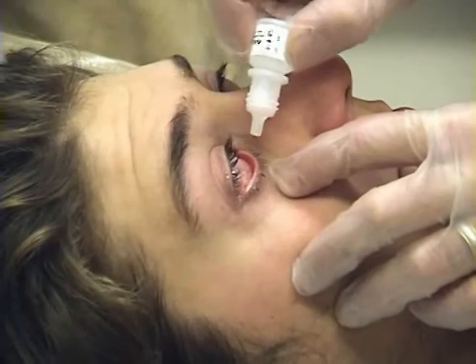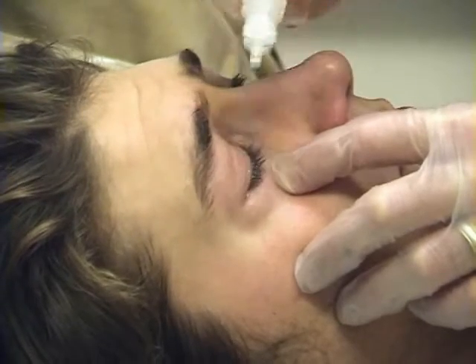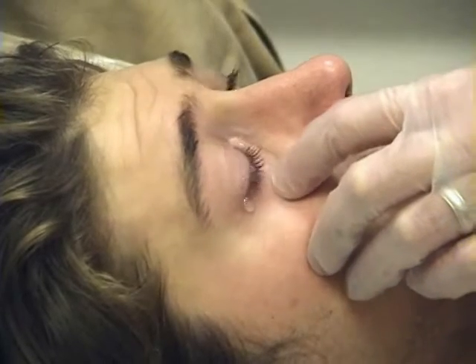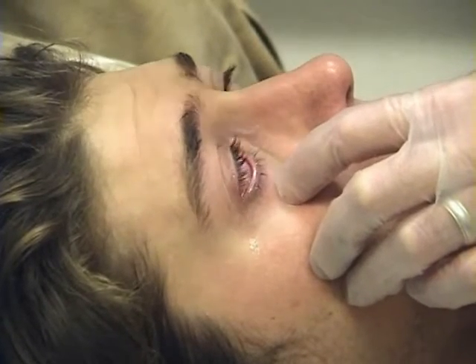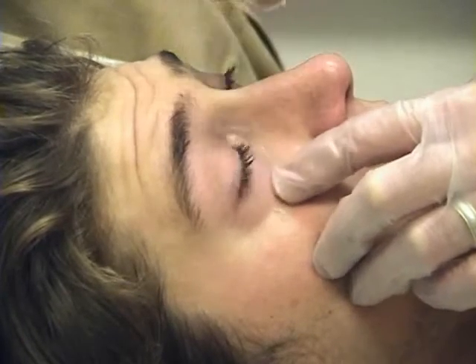Next, place 2 drops of topical ocular anesthetic in the affected eye. Ask the patient to look upward and place the medication into the inferior fornix. Instruct the patient to keep his eye closed after the application in order to retain the medication.